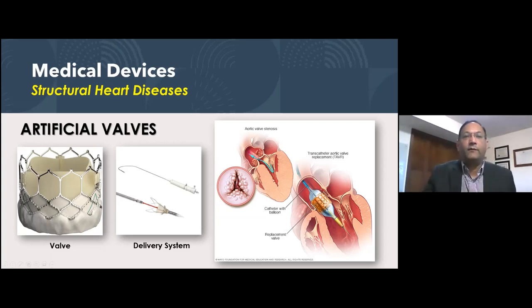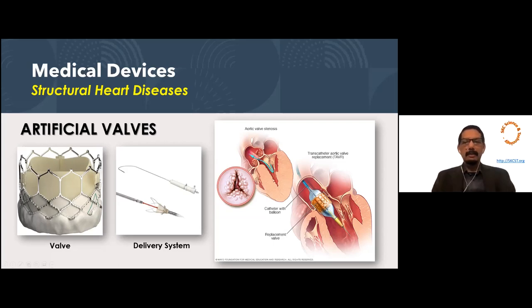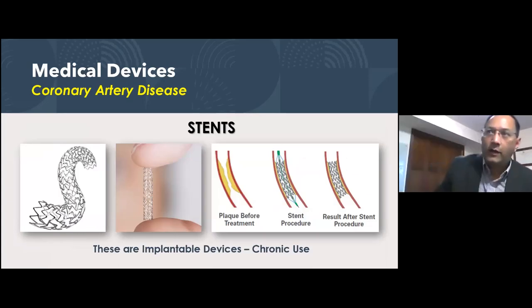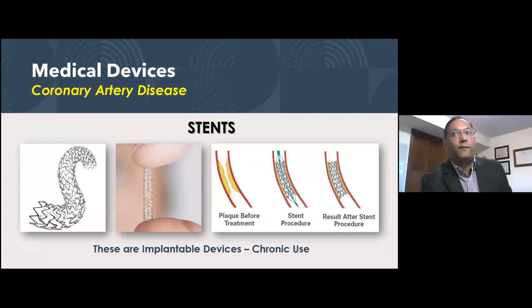This is a quick question going back to the stent. What type of bench testing is done for flexibility of stents? There are a number of big categories of testing. One is on the material side, structurally, for flex testing. You put this on a tube and then you flex it for, like I said, 400 million cycles to reflect 10 years.